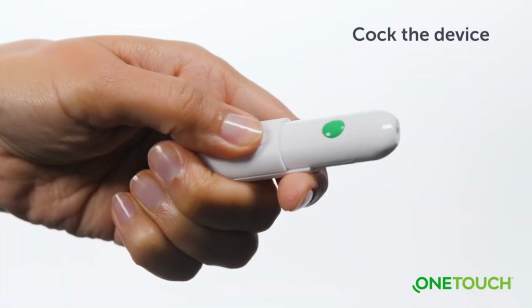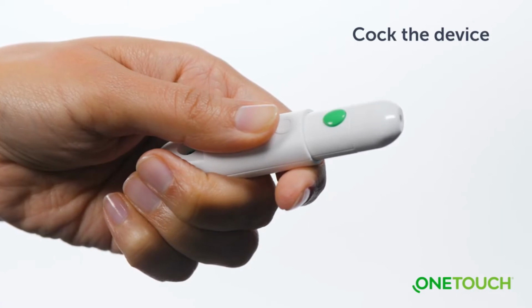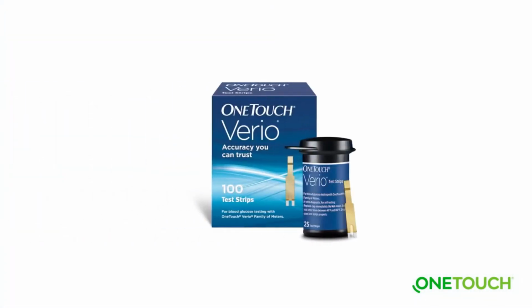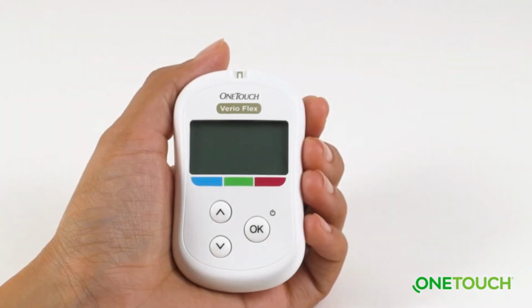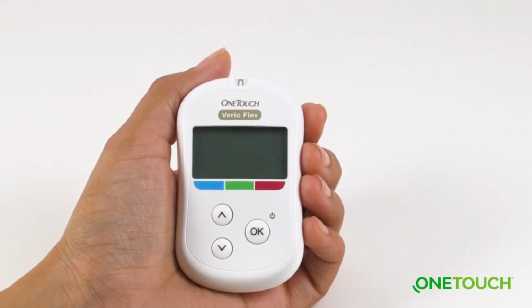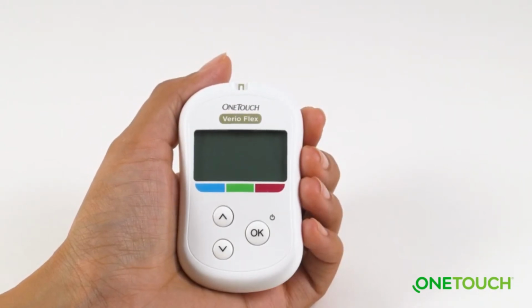With a new sterile lancet loaded, pull the slider back until it clicks. The OneTouch Delica Plus lancing device is now ready. Test strips are for single use only. Do not open the test strip vial until you are ready to remove a test strip and perform a test. Use the test strip immediately after removing it from the vial. Tightly close the cap on the vial immediately after use to avoid contamination and damage.